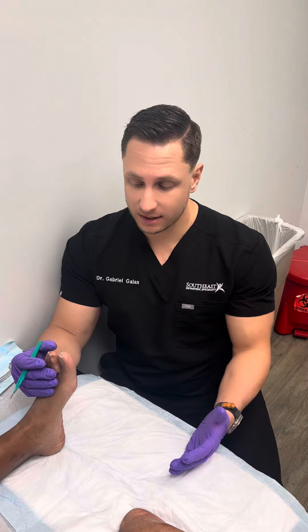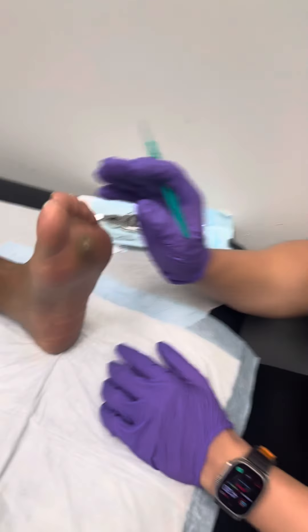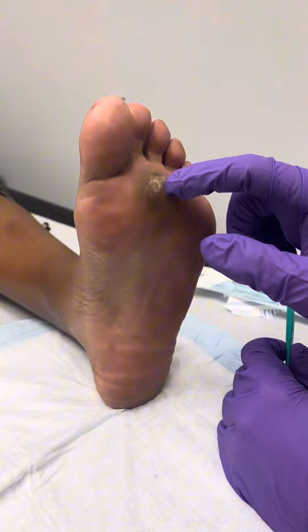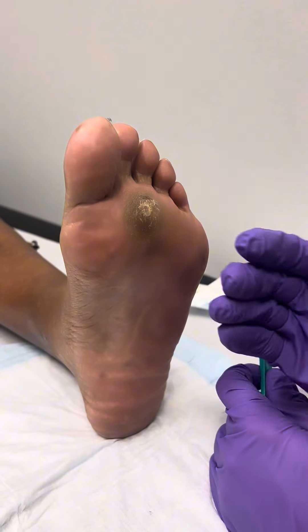We've got a patient coming in today with a really painful callus. This patient comes in periodically for us to trim down a spot on the bottom of her foot. If we flip around and take a look, we can see this really large callus underneath the ball of her foot, and this is due to excessive pressure.